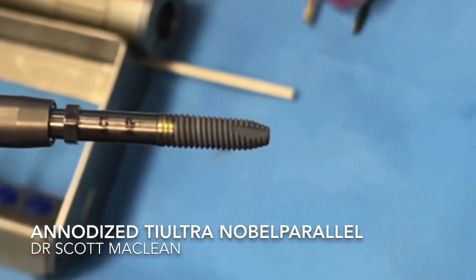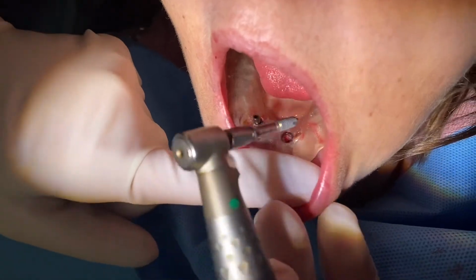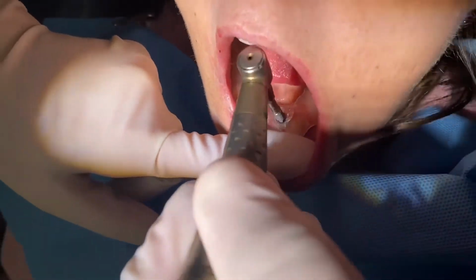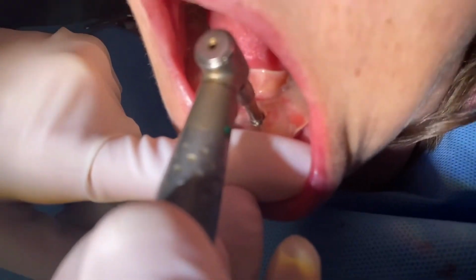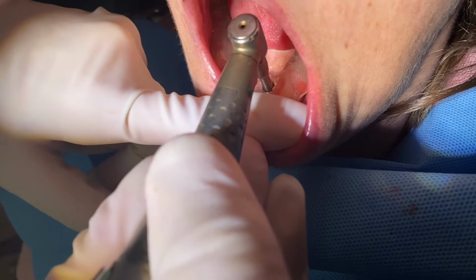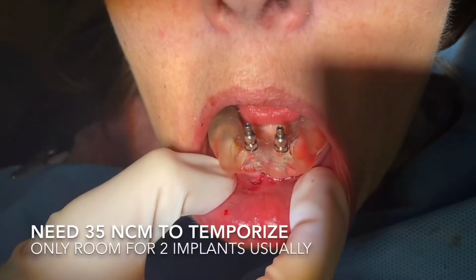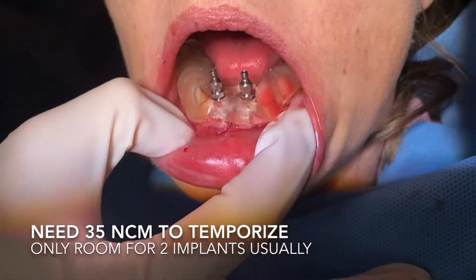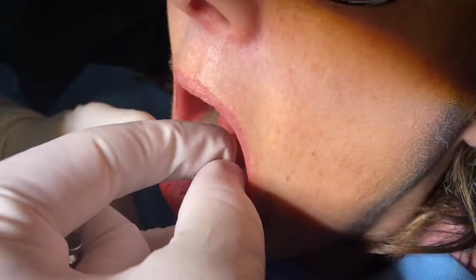Here's the implant. It's an anodized implant, and you can see that it has this gold anodization that happens. And so when we place this implant in, we get a better mucointegration with the implant, supposedly. So soft tissue and also the bone are exhibiting less inflammation according to some of the literature coming out. We can see we place the implants in position.